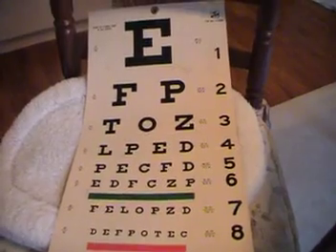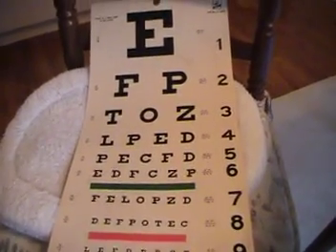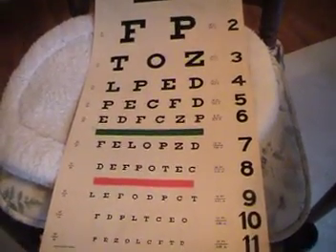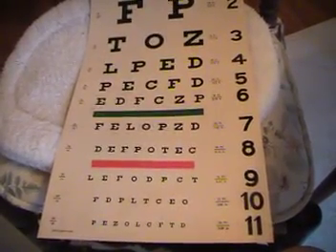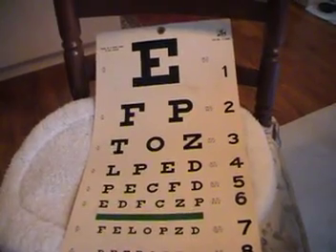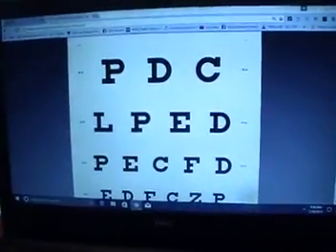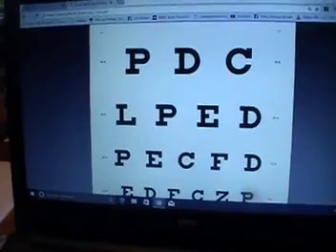And no one cares. So I suggest, if you get a Snellen, you write in big letters 20/60, 20/40, and 20/20. And then when you stand at 20 feet, you can objectively tell your visual acuity. I will include a chart for free, which you can download and mark appropriately. Now I will show you how to use a chart. This chart is for free, of course, and you can print it out.